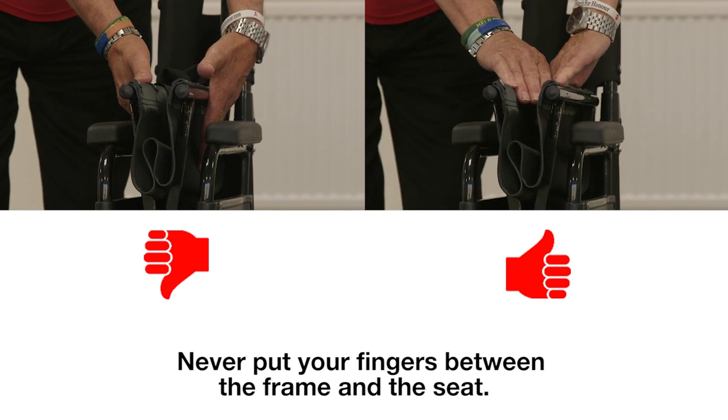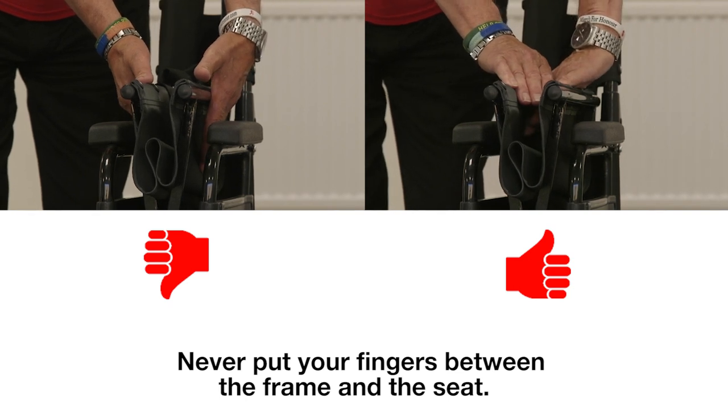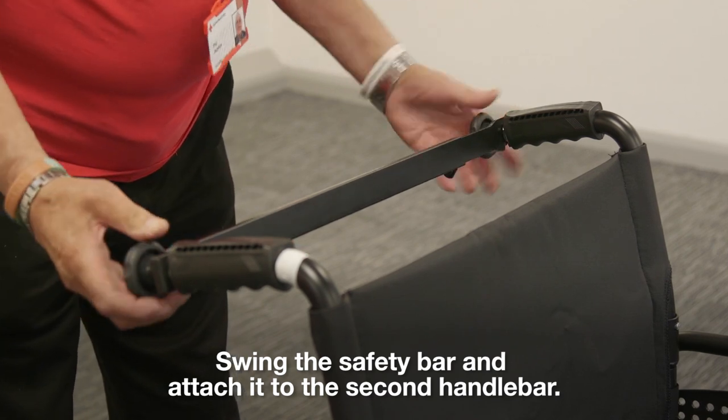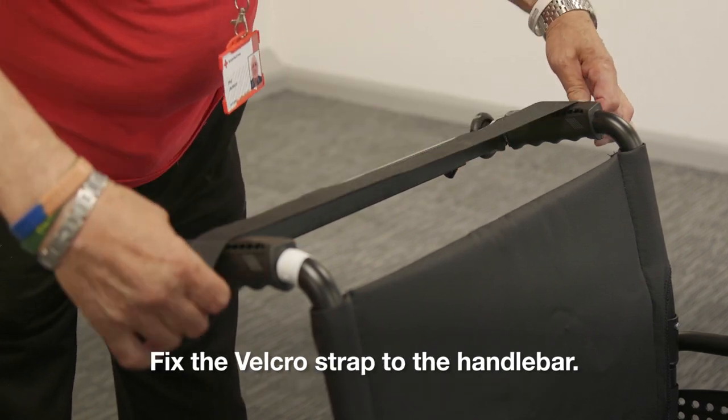Never put your fingers between the frame and the seat. Swing the safety bar and attach it to the second handlebar. Fix the velcro strap to the handlebar.